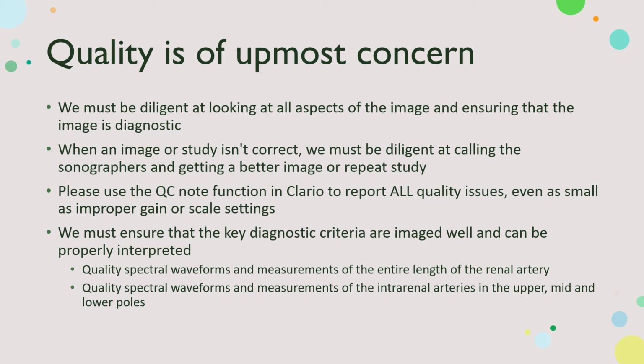And remember, we have a lot of contractors and temporary people coming through, and we need to make sure that we're upholding a high quality standard even when we have temporary techs coming through. And then make sure that we have what we need. So we need to make sure the waveforms are measured correctly, that they're following the entire renal artery, not just giving you one Doppler somewhere in the artery. They're giving you upper, mid, and lower poles. Make sure that the calipers are in the right place.